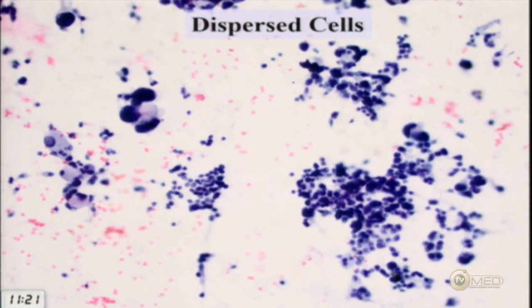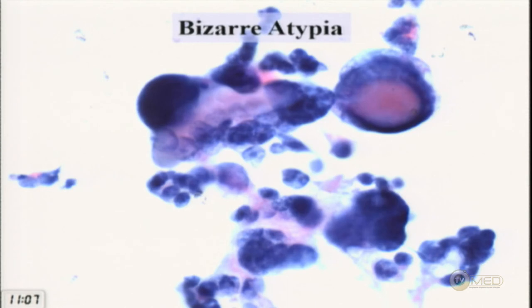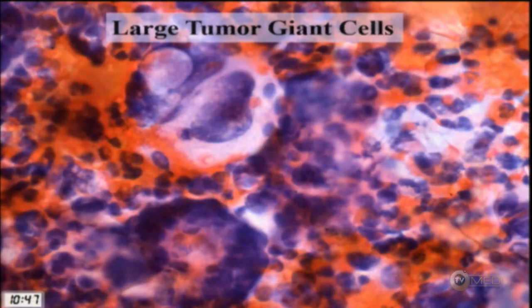An ultrasound-guided FNA was performed. The FNA shows an interesting dispersed population of cells and loosely cohesive groups, with some bizarre-looking cells at higher magnification — huge smudgy dark nuclei with inclusions, and a population of smaller dwarf cells in the background. A very bloody aspirate with these big ugly bizarre tumor cells with large inclusions and smaller atypical epithelioid cells.